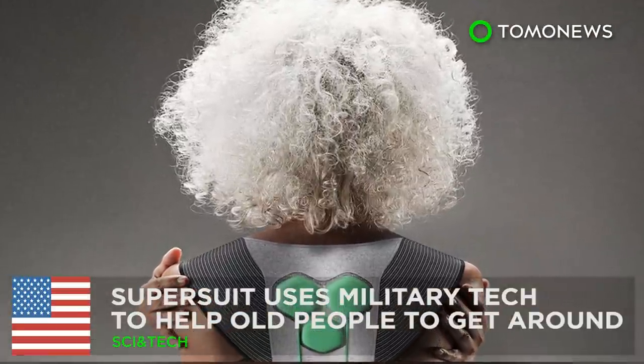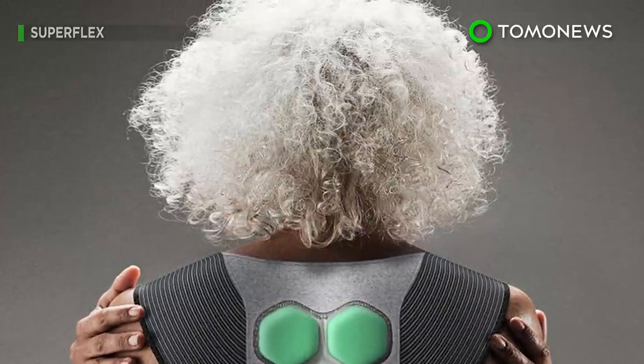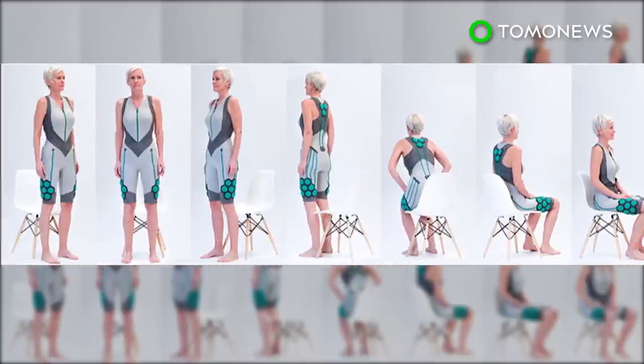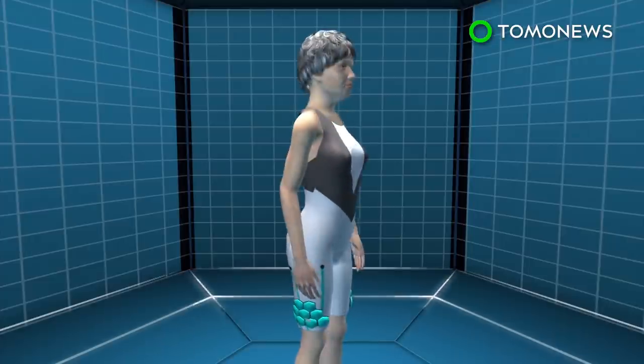This super suit can help your grandmother get around more easily. A California-based startup has designed a powered suit that can provide extra muscle strength for elderly people and increase their mobility. The Aura-powered suit is a smart suit designed to be worn in direct contact with the body.